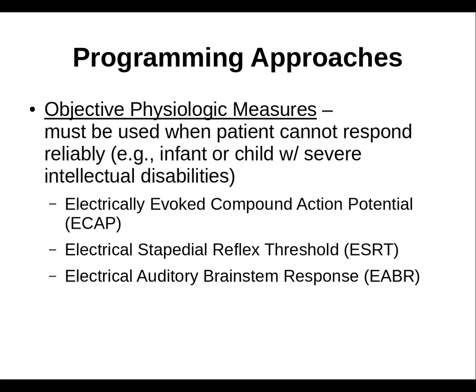And then third, the electrical auditory brainstem response. Again, similar to a standard auditory brainstem response, except instead of having the acoustic click stimuli, we're going to have an electrical current being sent down to the electrode to the cochlea.